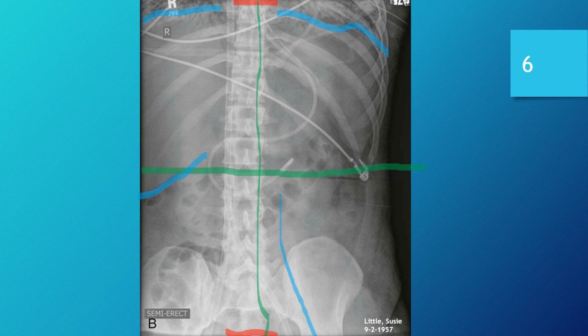I believe that's a profile of one there. The upper portion of the right one may be in this area here. But that, of course, has to do with the positioning and the choice made for this image as far as that's concerned. But as far as visible structures, the contrast is definitely there for this exam.